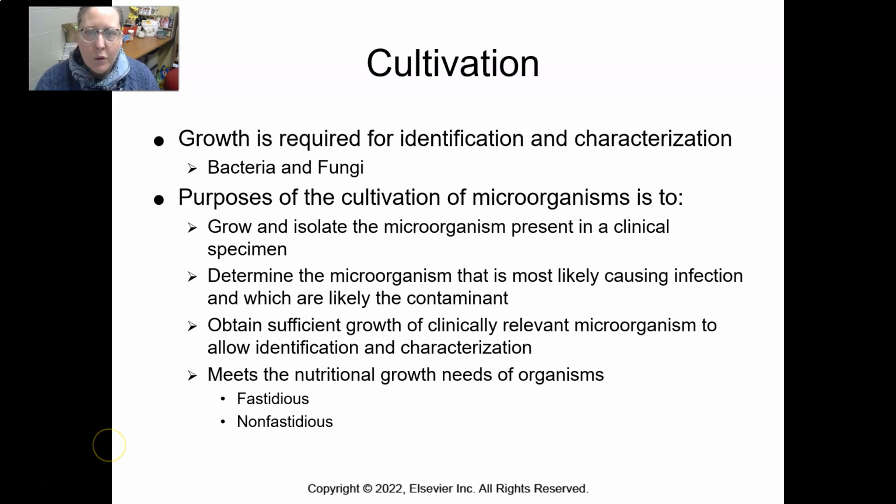Alright, so cultivation, which is growing the microbes, is required for identification and characterization of certain, at least bacteria and fungi, although now with more modern methods, we have gotten a lot better at direct testing on specimens, which we'll talk about. And so, we have some direct or quick testing available, but it still doesn't cover everything that we can find and everything that can cause infections.